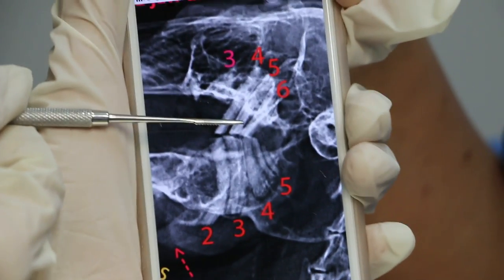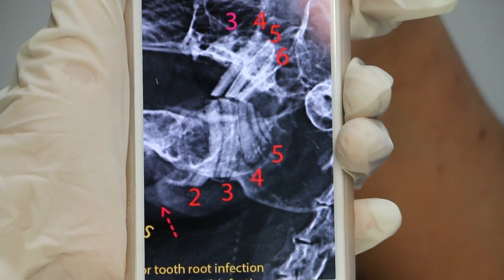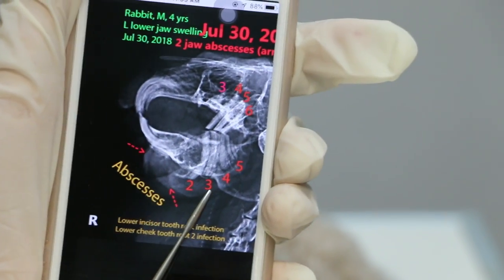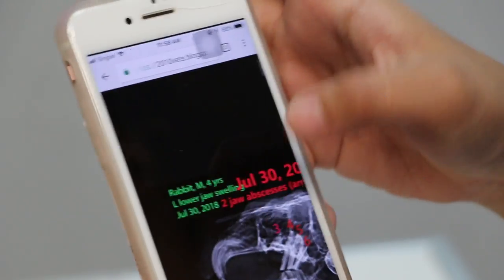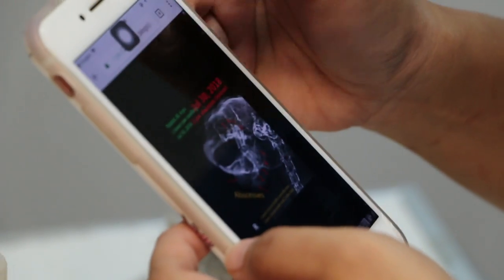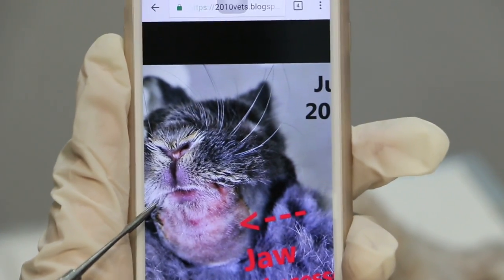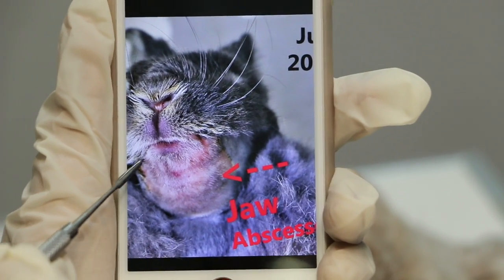This is the X-ray of a rabbit with rotten teeth. Normally there are six cheek teeth on top but here there are only four. Below there should be five — and you can count five. The arrow shows an abscess from the rotten roots — pus and bacteria forms below the chin. Here you can see the photo of the rabbit itself showing the left cheek jaw abscess, which is abnormal.